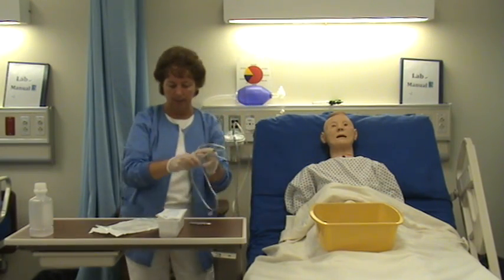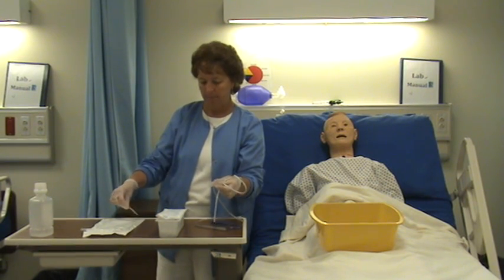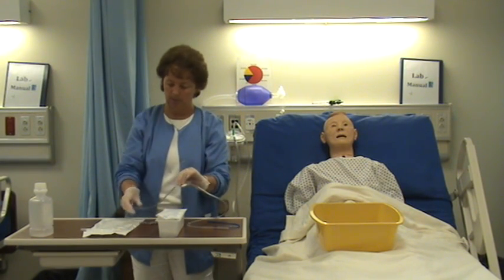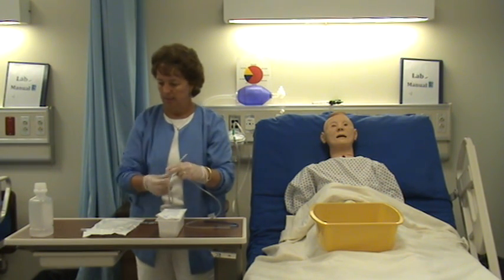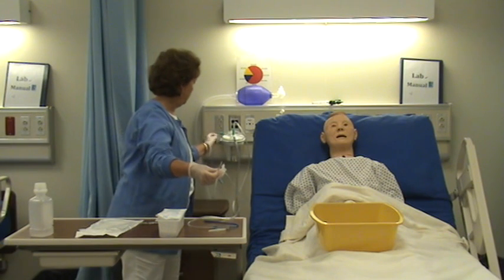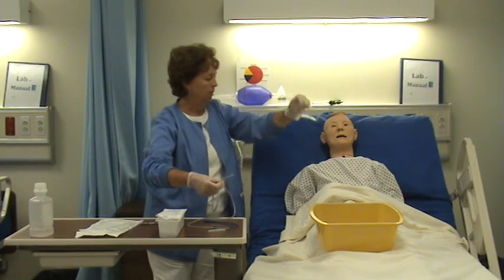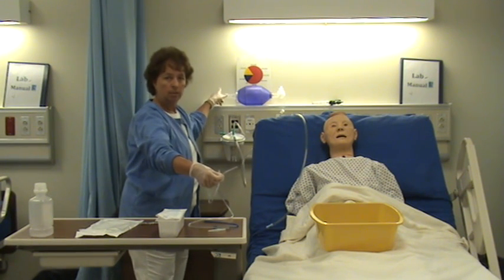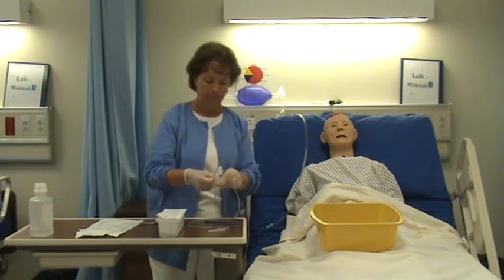I'll open the lubricating jelly, put it on some paper, and lubricate the tube really well — probably about this far. We don't use lubricating jelly on the mannequin; we have another lubricant for that. I also have a connection port to connect the NG tube to the suction canister on the wall or beside the bed. I've got my suction ready, turned to low intermittent, which is usually what is ordered, and I've confirmed that's the correct setting.